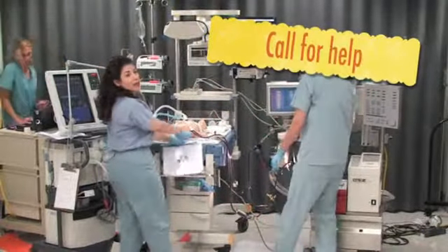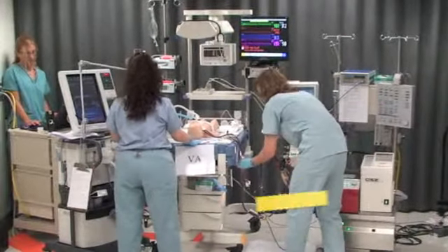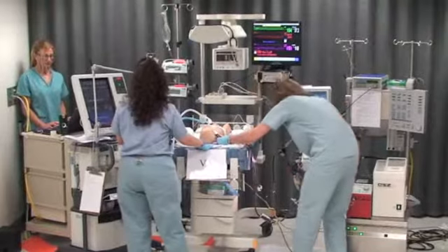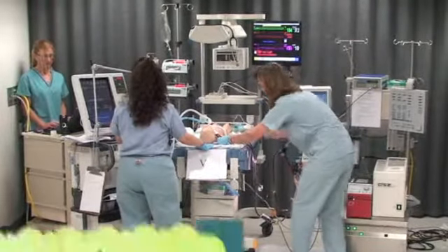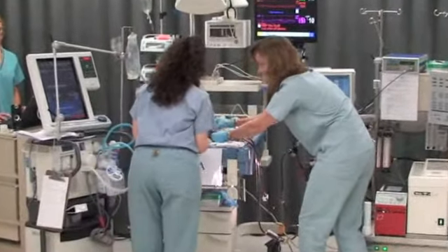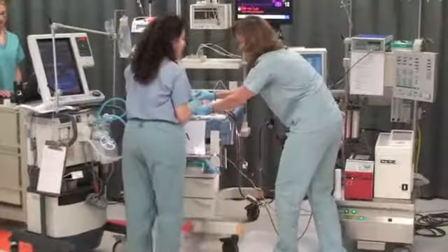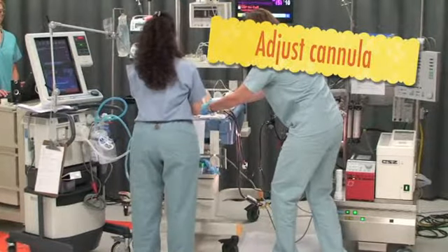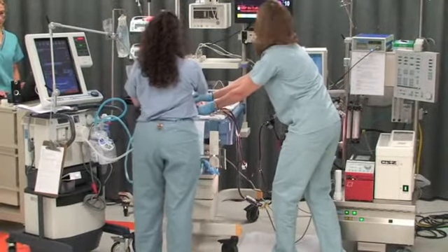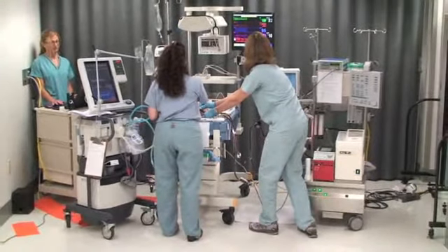Should I go to emergency? Let me look at the arterial side and see if I can find what's going on. I'm going to look under the pressure bandage. There's a big kink in the cannula — on the arterial cannula. Do we need to come off? I think we're okay. Let me just try and straighten it a little and see if that helps. It looks like that's it.